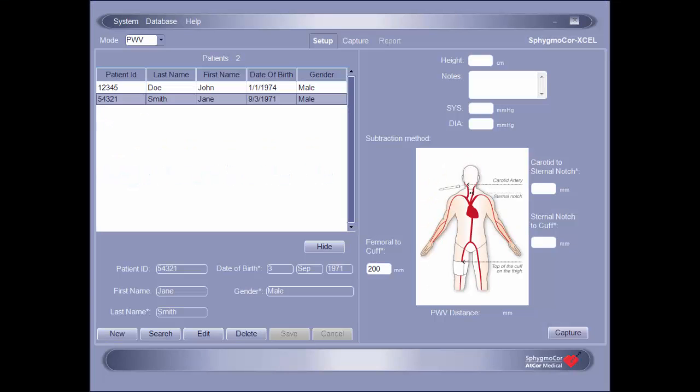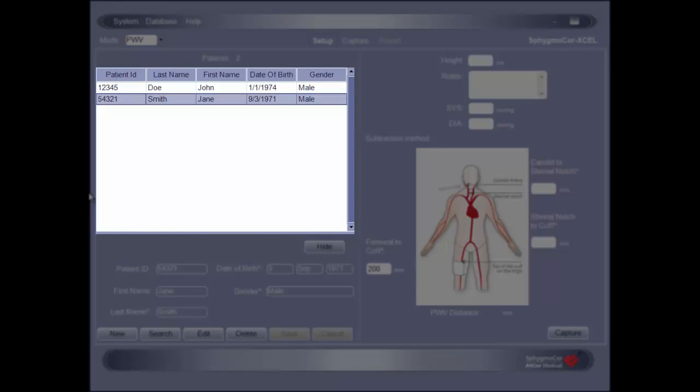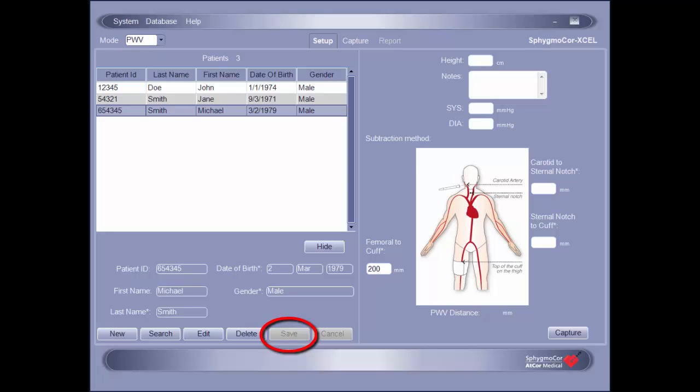If the patient has already had a profile created in the SphigmaCore XL software, locate that profile in the patient list and then proceed with the assessment initiation. To create a new patient profile, click New in the lower left-hand corner of the setup screen and enter the patient information into the appropriate fields. Required fields are noted with an asterisk. A minimum of a single character can be entered into any field, with a maximum of 10 characters for the patient ID and 25 characters for the last and first name fields. Once the information has been entered, click Save to save the patient's profile.